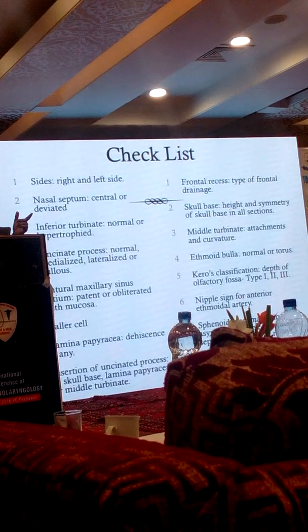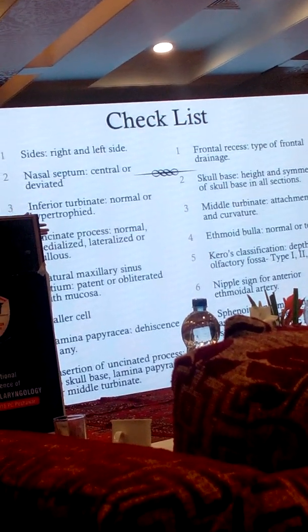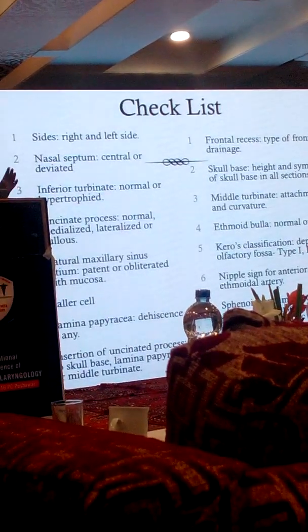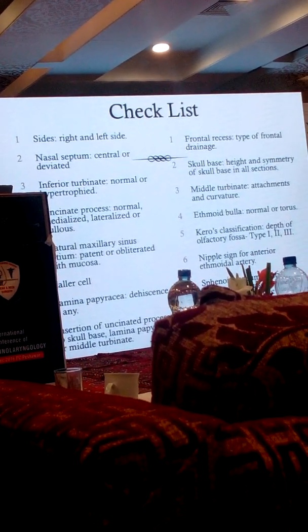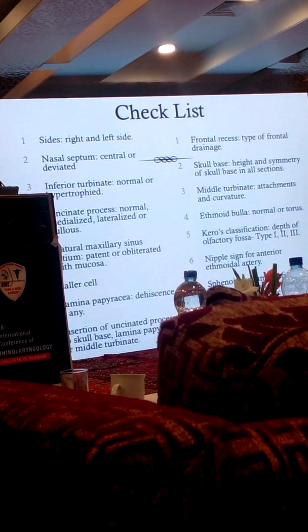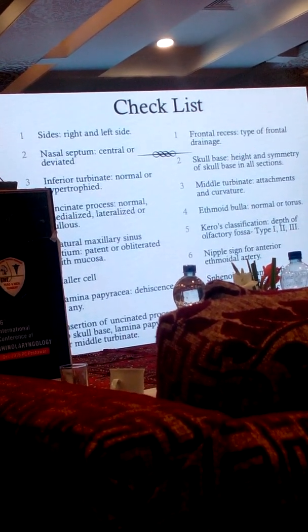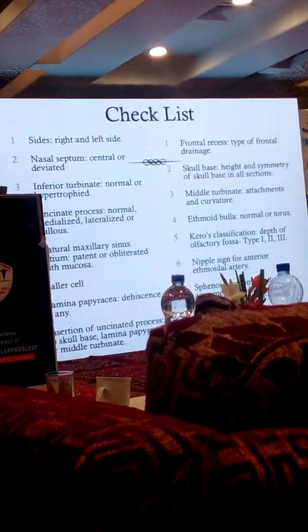And one thing, films are outdated. We cannot read a CT scan on films. They would have to give you 100 films. So it has to be on a workstation. We have to have that software. If somebody gives you films, then please ask them to give you a CD. Every CD comes with a small program which you can run on any computer.